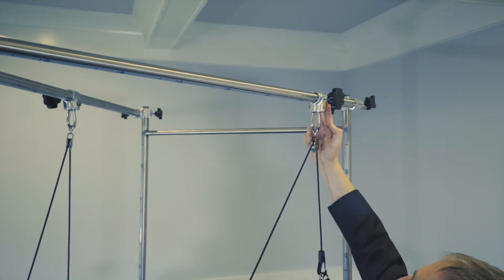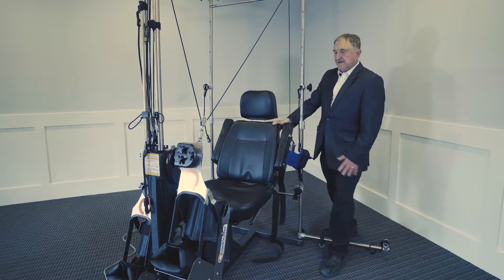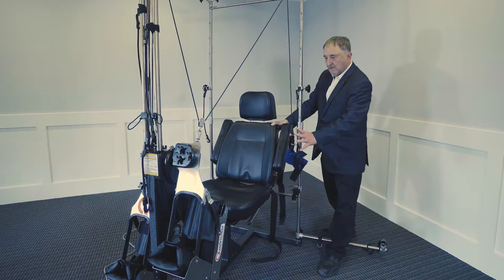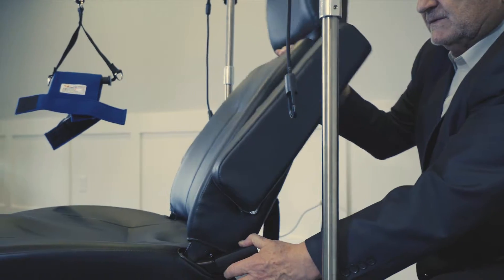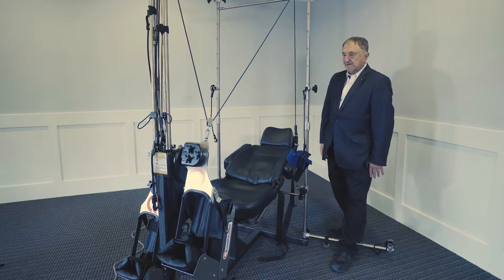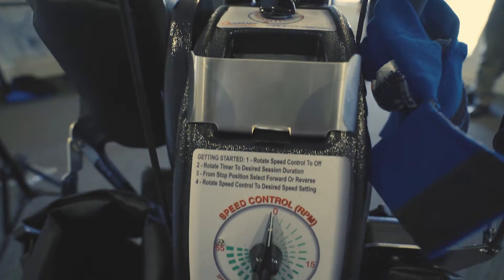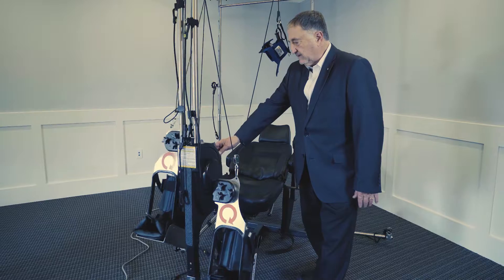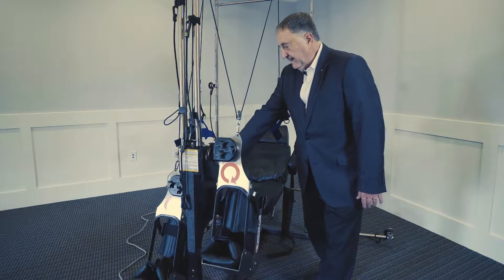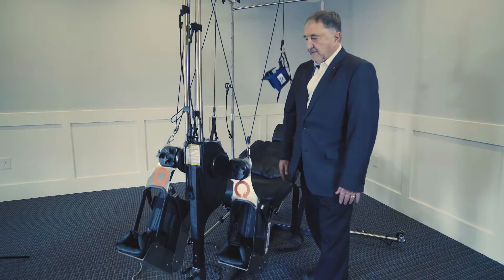This is very easy to slide back and forth to get different ranges of motion. When you're using it in this position, you get more dorsiflexion. When you lay it in this position, you get more plantarflexion, but it also simulates walking. It has a timer which is 30 minutes, a speed control from 0 to 65 RPM, and it goes in reverse also, which works different muscles.